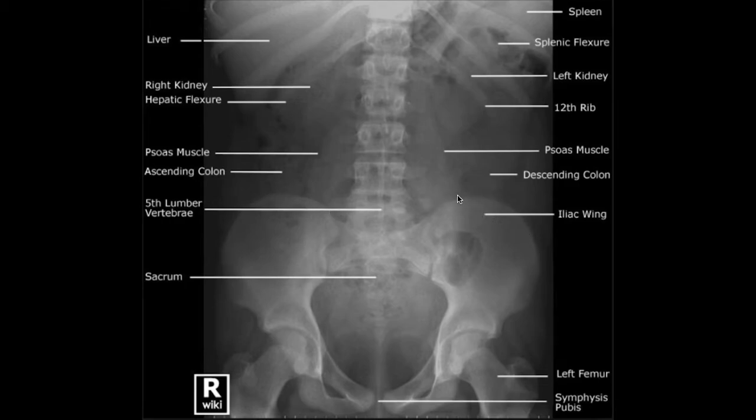It's part of the bony region. The crest is right here, and the wing is right here. This is the iliac wing. Okay, so this is part of the bony region. Coming down, we can see the sacroiliac joints. We have the left and right SIJ, sacroiliac joints. They are nice and visible. Then we have the sacral bone right here. And we have the tailbone or the coccyx.